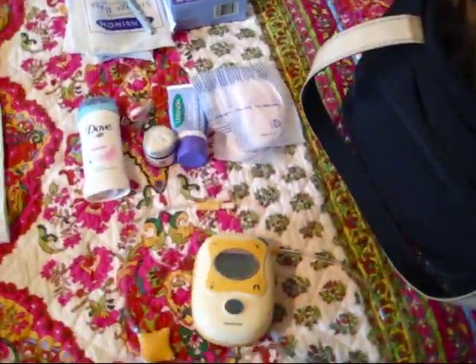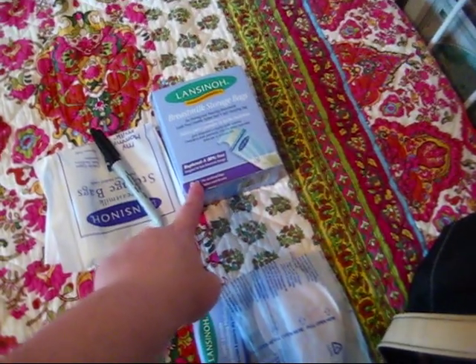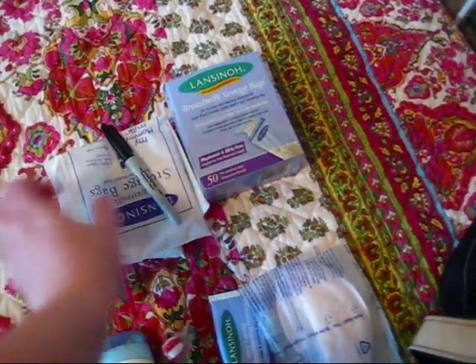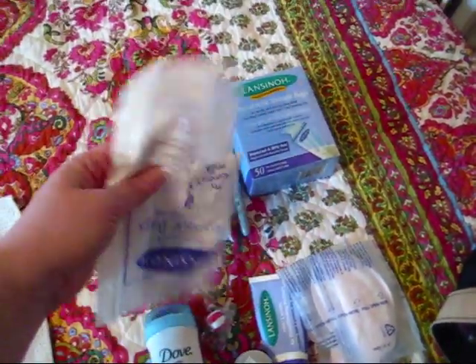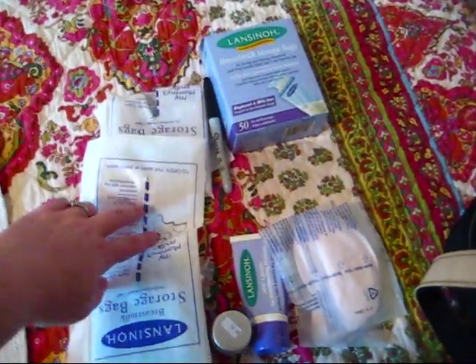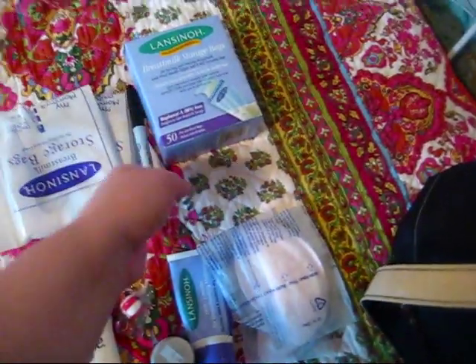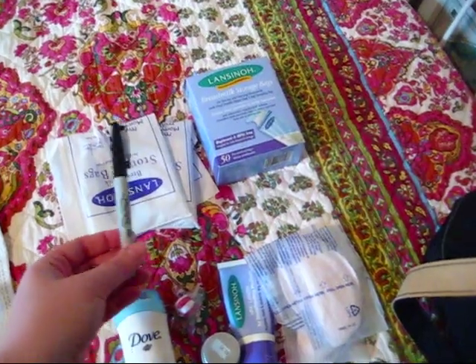Besides the pump, what I usually have with me at all times is some Lansinoh Breast Milk Storage Bags. This is what the box looks like — they come in 25 and 50 count. You can get them at Target or just about anywhere. The bags themselves come in a smaller bag to keep them clean, and you just reach in and pull one out. I also bring a permanent marker so you can write the date and the amount of milk on the top of the bag.